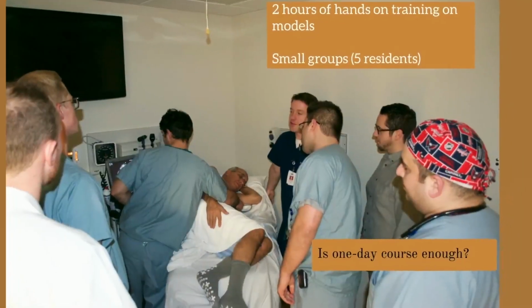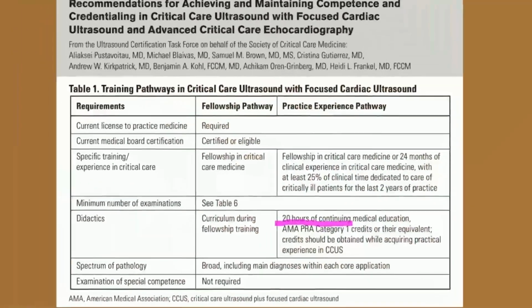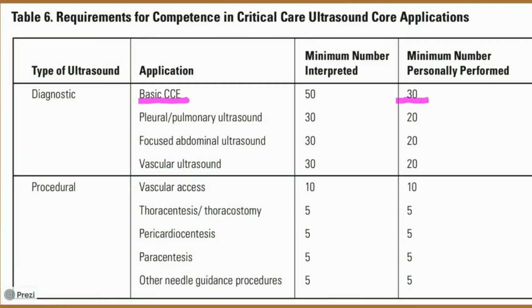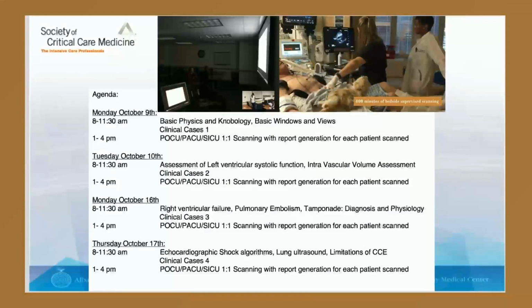But do you think 1 day is enough? I mean, the Society of Critical Care Medicine said you need to have at least 20 hours of lectures and then 30 exams performed and 50 interpretations. Can you fit this in 1 day? No. So we designed a 4-day course.